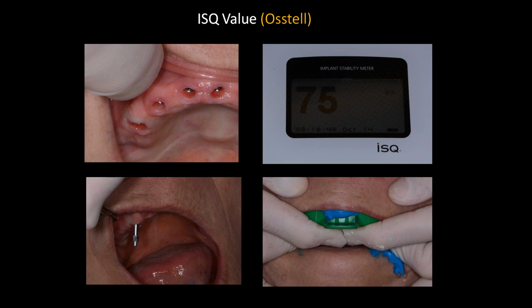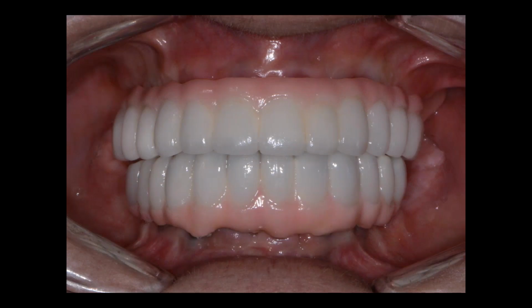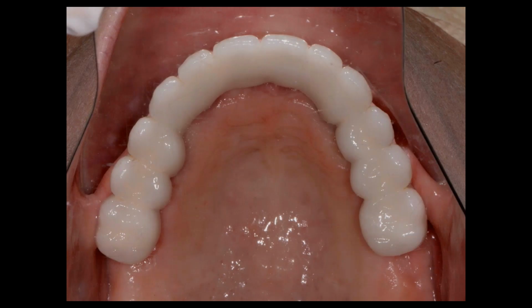So utilizing our Panasil impression material from Kettenbach, we take our full arch impression and bite, and here we have our final restorations. These are FP3 restorations according to Dr. Misch's prosthetic classification. Here we have the occlusal aspect, as you can see. So these are cement retained restorations.